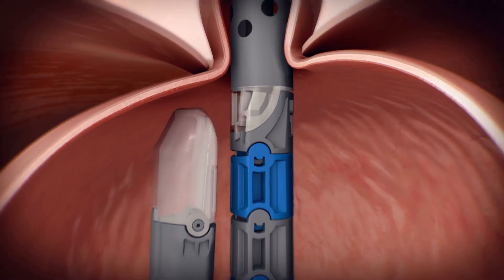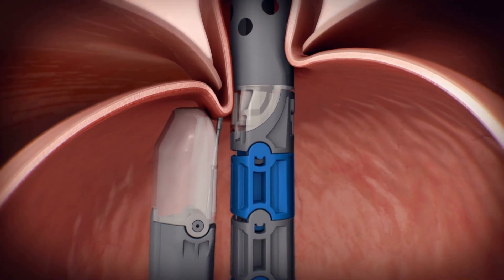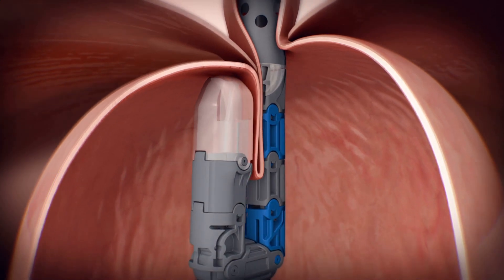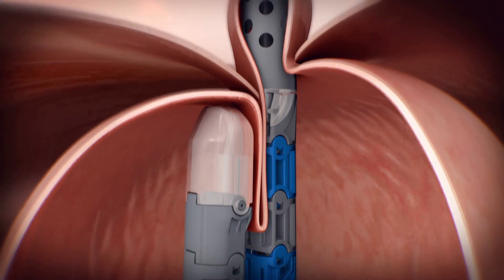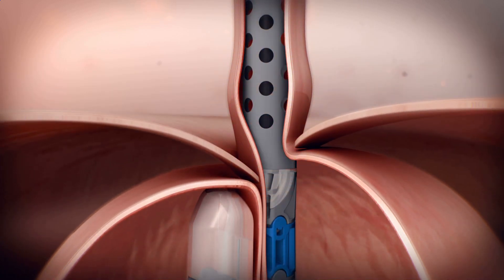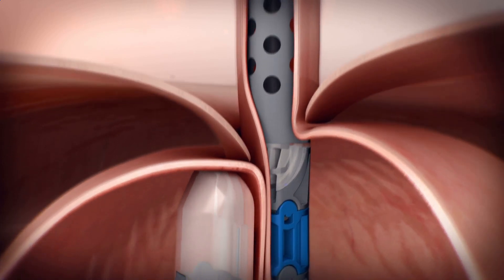The valve reconstruction starts with the engagement of the helical retractor at the gastroesophageal junction. Then, tissue is retracted into the tissue mold as the EsophiX device is rotated, wrapping the fundus toward the lesser curvature of the stomach. A small hiatal hernia can be reduced and the intra-abdominal length of the esophagus can be restored using suction built into the device.